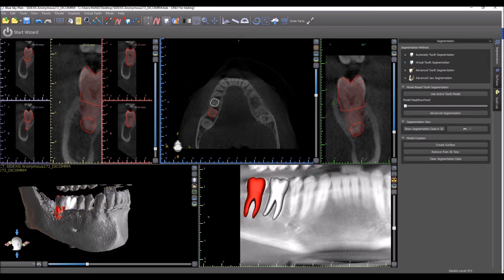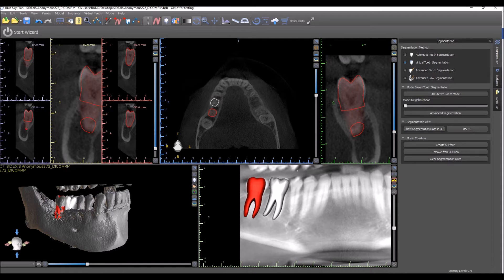There are different options in Blue Sky Plan to segment and remove teeth, or to segment and clearly define a jaw. In a situation where you're interested in extracting teeth or creating copies of the teeth, you're going to be using either the automatic tooth segmentation, virtual tooth segmentation, or advanced tooth segmentation. In a situation where you have an edentulous jaw and you're going to be creating a bone-supported surgical guide, you would use the advanced jaw segmentation. Each segmentation option varies in terms of how much time it takes and how accurate the results are, and in different situations, different segmentation techniques will be suitable.